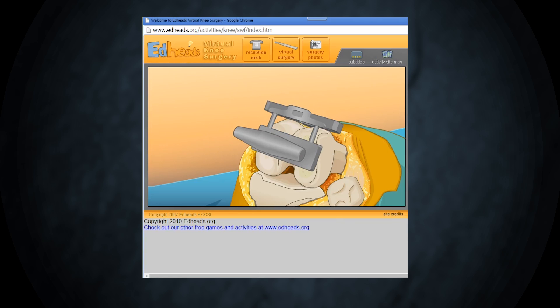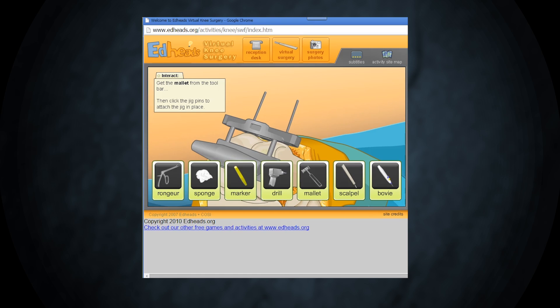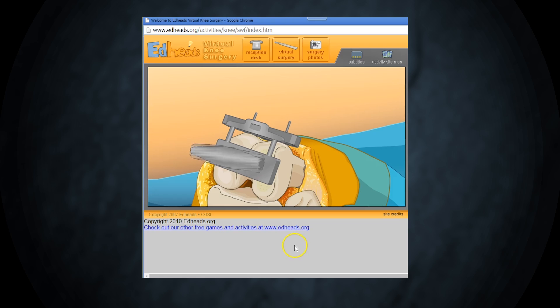The jig is put into position and helps ensure that the cuts made to the bone are exactly what are needed. Hammer in the pins to hold the jig. We can now remove the alignment device. The pins will hold the jig firmly in place.